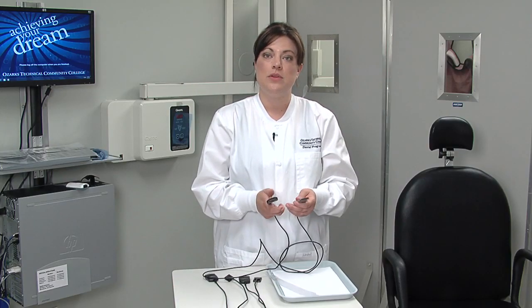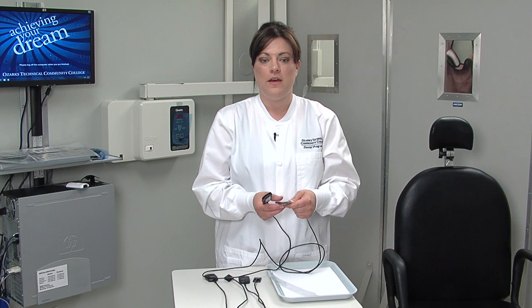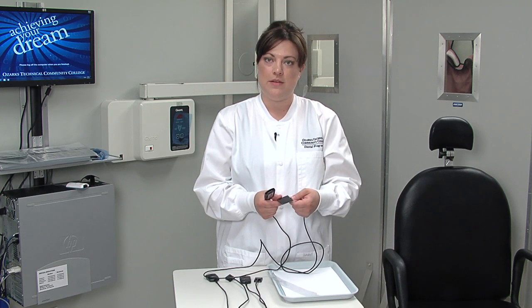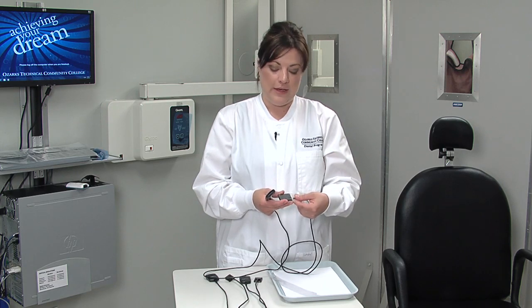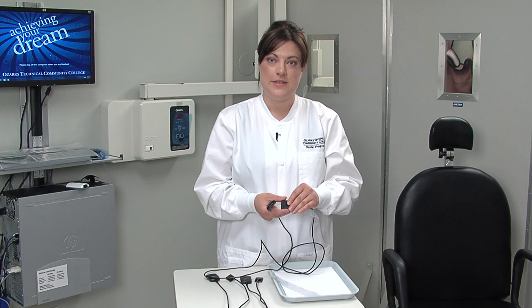You just need to plug it in to the remote located behind me. And what the remote does is the radiation that is sent on the sensor will send a message through the cable, which then connects to the remote and transfers through the USB port to deliver that message to the computer and create a picture based on what was absorbed here on the sensor.